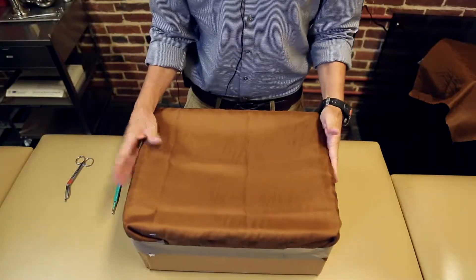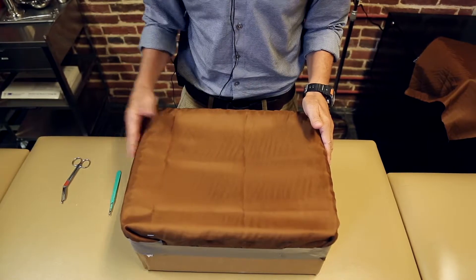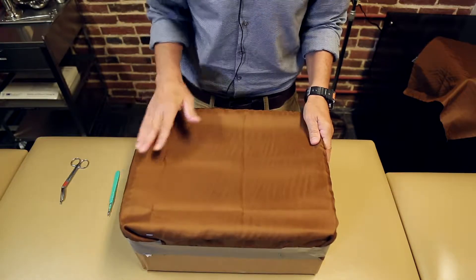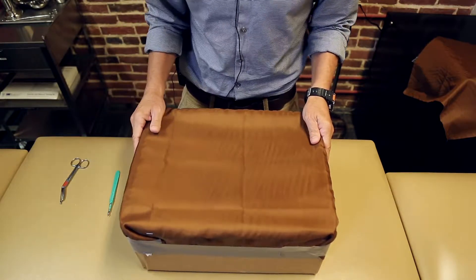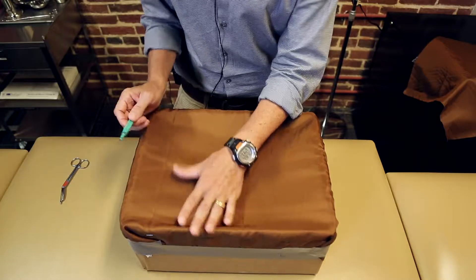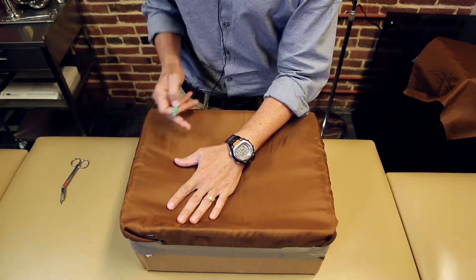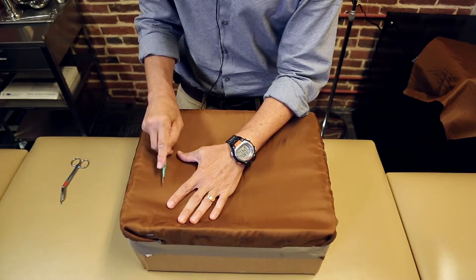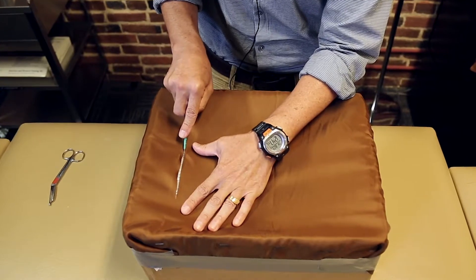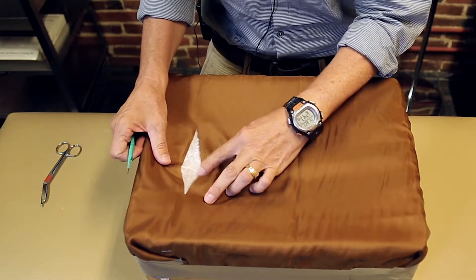Now we've assembled the box and we're going to show you going through the layers. It's good to identify the layers with the surgical team beforehand so they're familiar with what each layer looks like. We'll start with the skin incision — if it's nice and tight it will be easier to cut through. Use your landmarks such as the symphysis or the anterior superior iliac spine to identify where you'll make the incision, then cut through. There's your skin — now we're down to the bubble wrap.